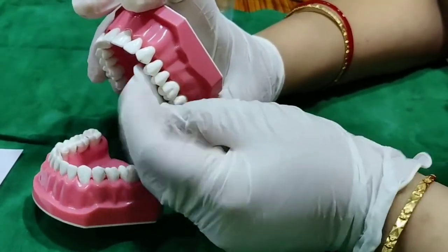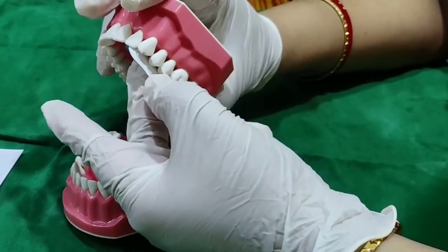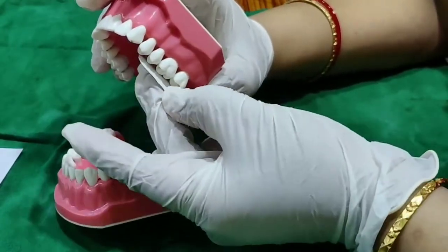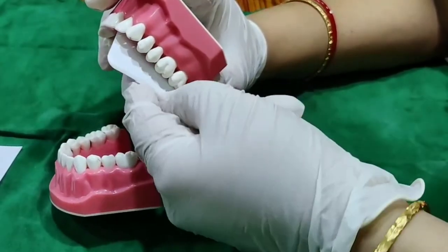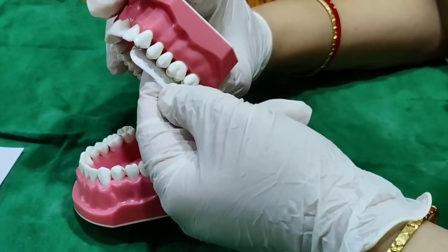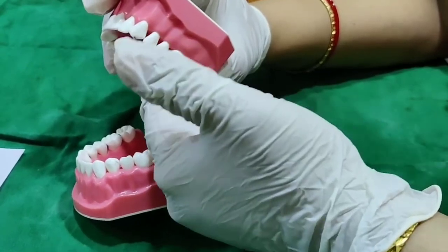For tooth 4, it should be at the center of the film. For tooth 5, move the film accordingly with tooth 5 at center. For tooth 6, the position changes further posteriorly and the tooth 6 should be at the center. For diagnostic, the border should be 2 mm below the incisal edge. For endodontic, just push the film inside because we are interested in the roots, not the crown.